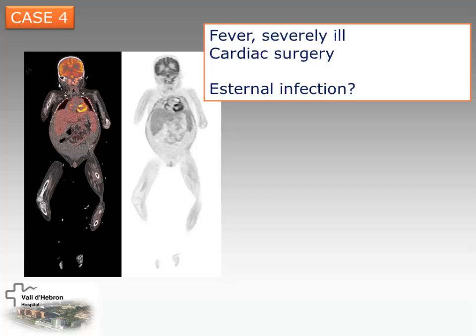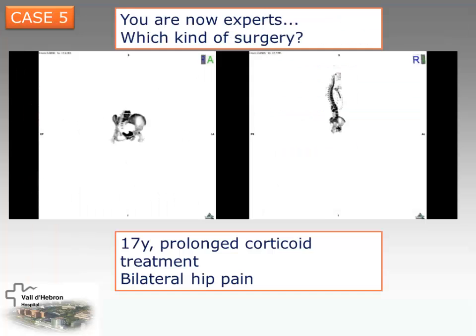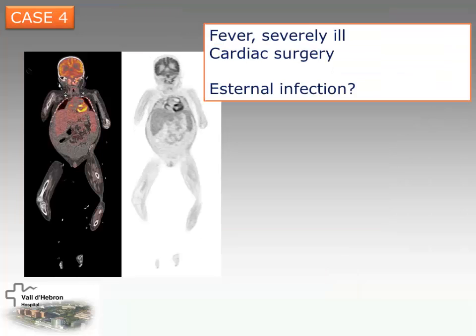But what happened in the mediastinum? We can see some activity, like multinodular. No, I'm sorry, I have no more images. The mediastinitis, okay. It was a big increase of activity at the sternum level, with a big mediastinal mass and activity around a lot of mediastinal collections. There are multiple mediastinal masses. No lymph nodes, no. Abscess. Abscess.